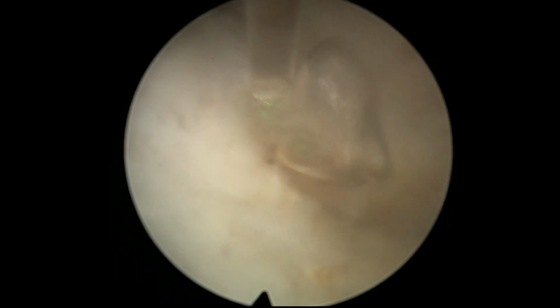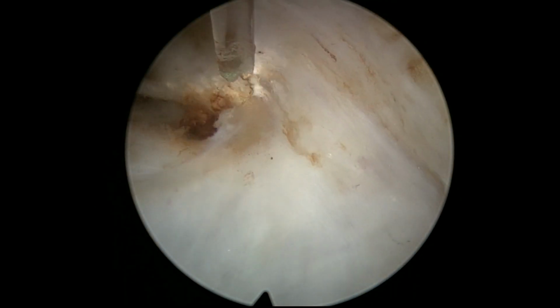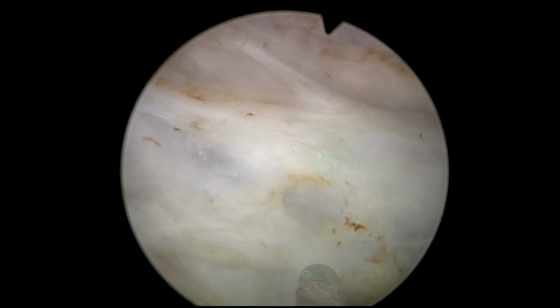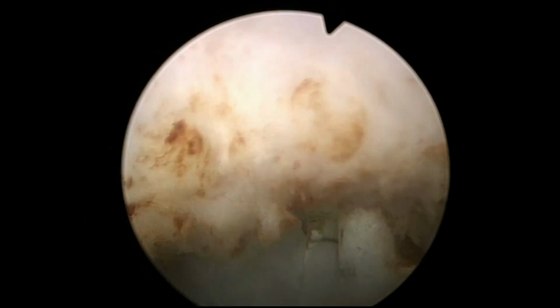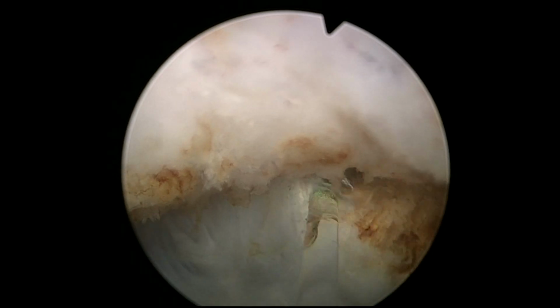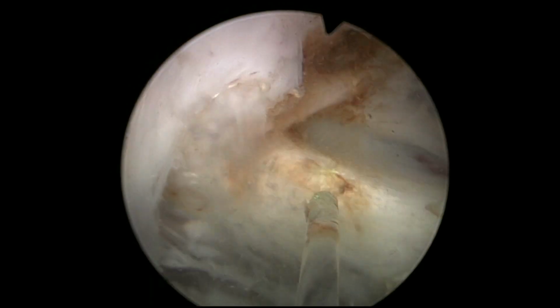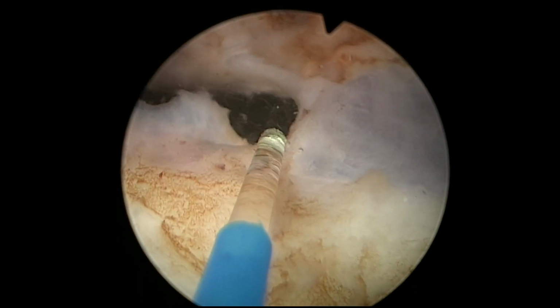So it's pretty good and pretty standard nowadays for prostates such as this. And I'm very happy that the tools are constantly improving, and companies are investing a lot of money to improve our experience as surgeons. I think we are going to see a major adoption of anatomic enucleation worldwide. We are seeing it. I get requests from people who want to be trained and who want to learn, who want to visit almost every day. Someone is writing us and saying, "We want to visit you, we want to learn." So I can tell you the interest in HoLEP and endoscopic enucleation is peaking right now, as it had to be, because the results of this technique are amazing.